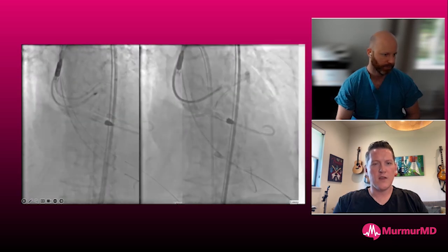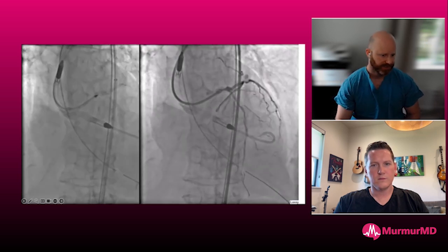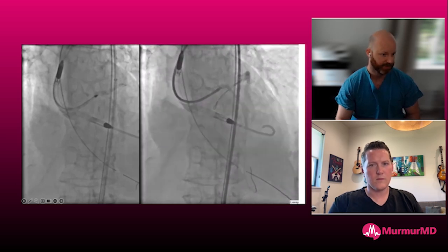So as I said, we were going to be upfront with atherectomy here. We went Rota left main to LAD. We felt like if we modified the left main plaque, we weren't going to have to Rota into the circ. So we went Rota left main to LAD, got down that, went ahead and wired both ways. You can see here we've modified the plaque quite dramatically. It doesn't look great yet, but we've modified the plaque and made a path for us to sort of move on with our day.